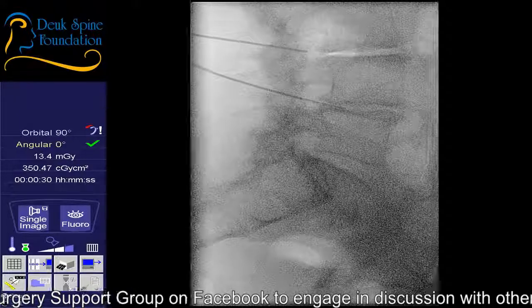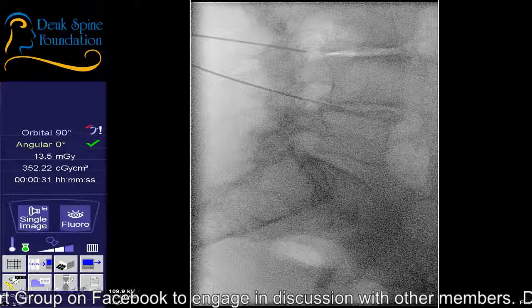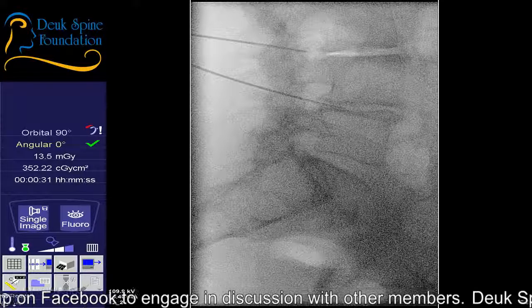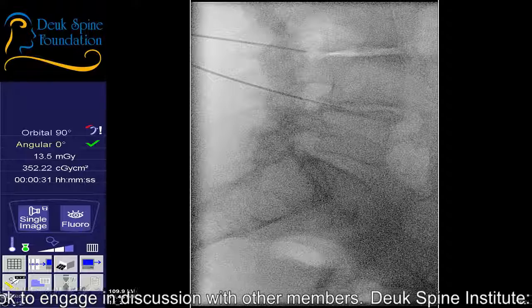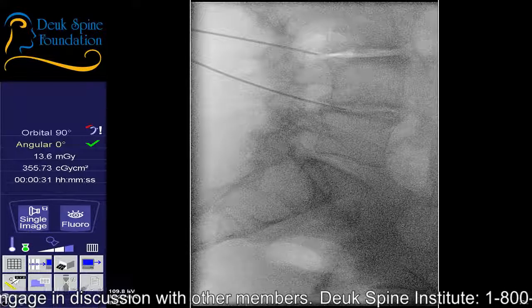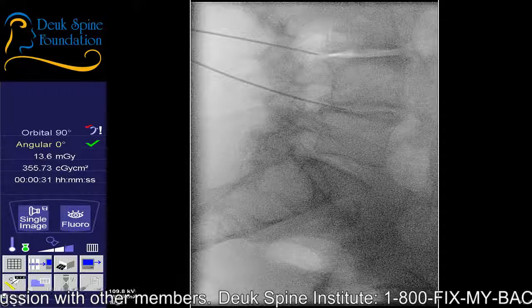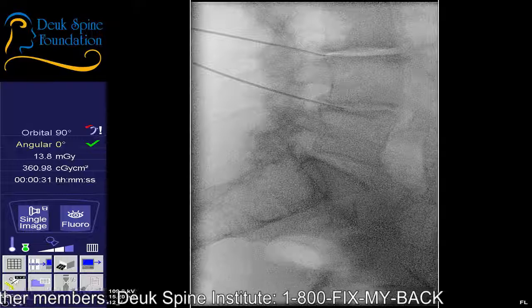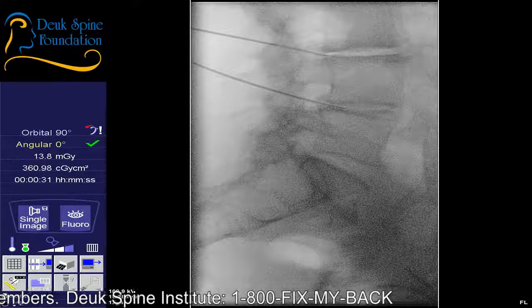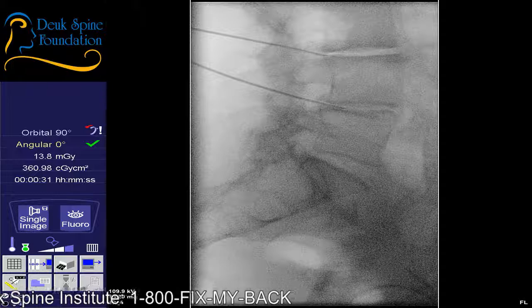Where do you feel that pain? Is it still in the back or going down your leg? On the back. Okay. All right, we're almost done. We're just coming up against your herniation, and it's a big one. Once again, and the bone spur is really deflecting me.